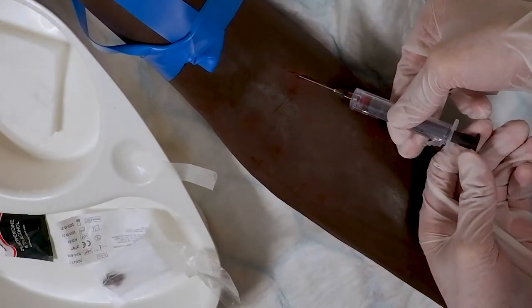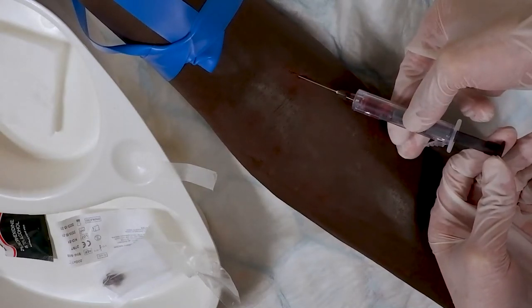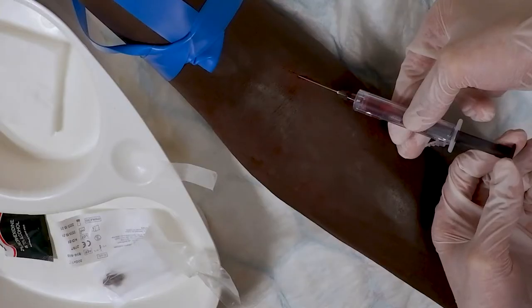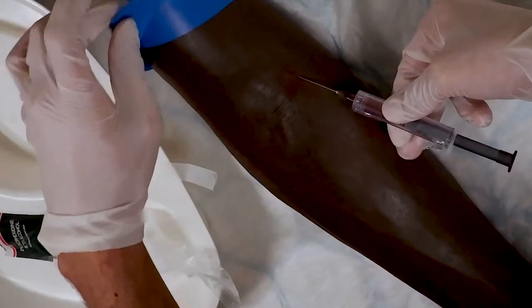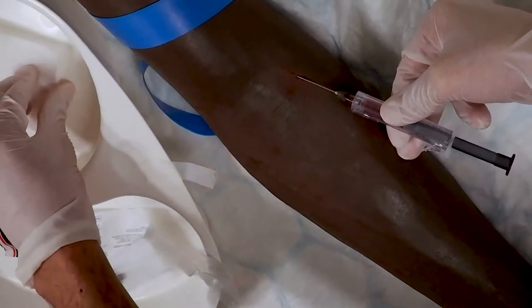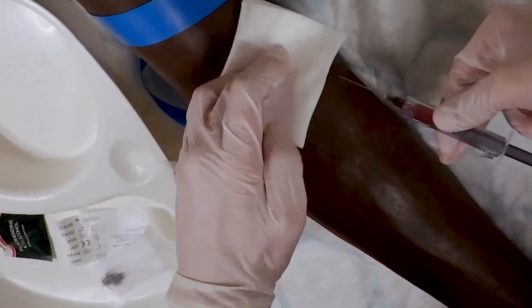Gently withdraw the plunger and obtain a minimum of 0.5 mils of blood — any less than this and it may not be possible to process the sample. Release the tourniquet and place gauze over the puncture site, applying pressure to the site.